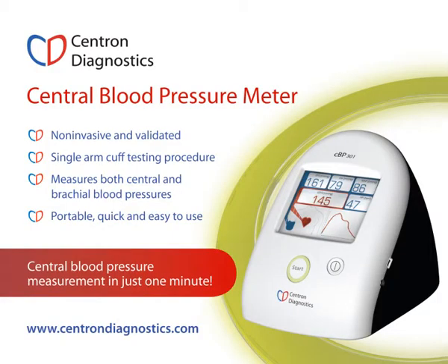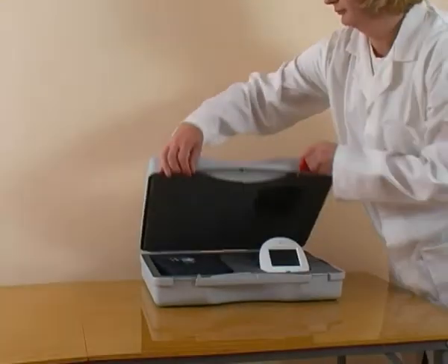The CBP301 is the first instrument to incorporate measurement of central blood pressure in a standard automatic arm cuff monitor. This short video demonstrates its operation. Your instrument is packaged in a carry case containing the following items.